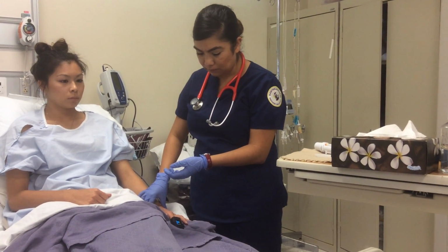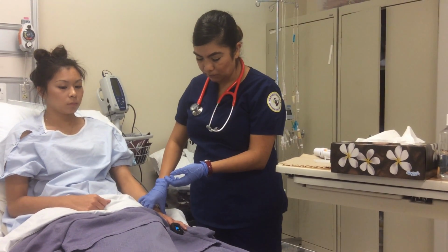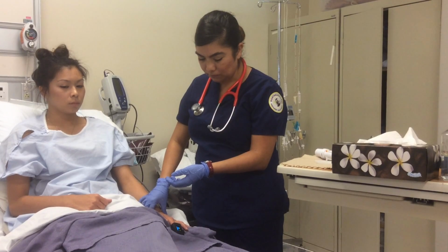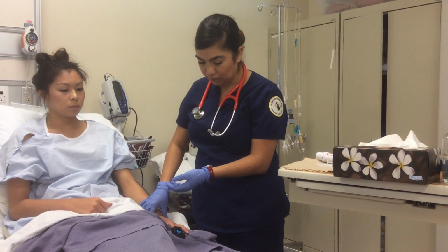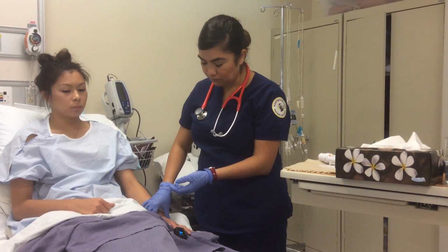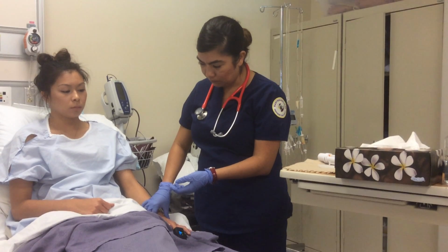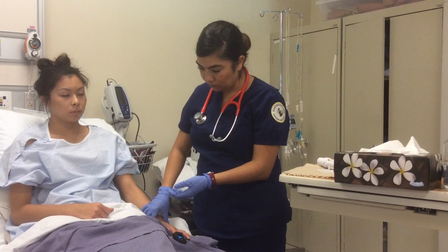And I'll also do pulse ox. I'm going to leave this right here, okay? And then you want to check first the patient's pulse, because the saturation will be together. It'll be together. That's how you know it works.